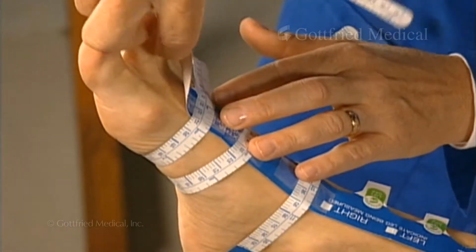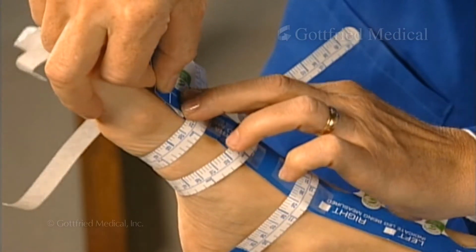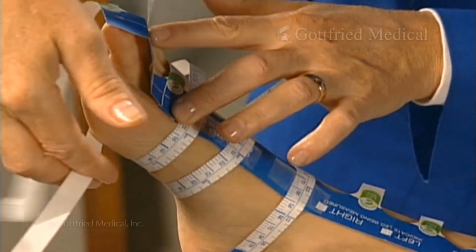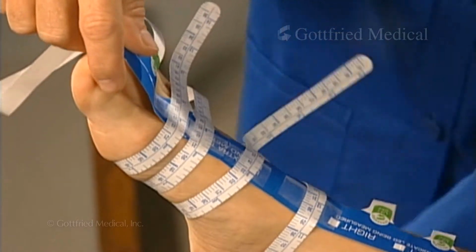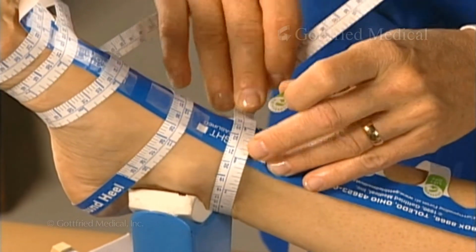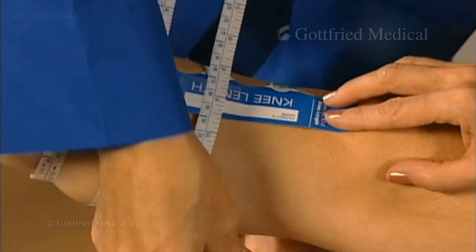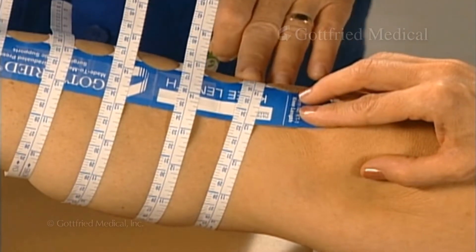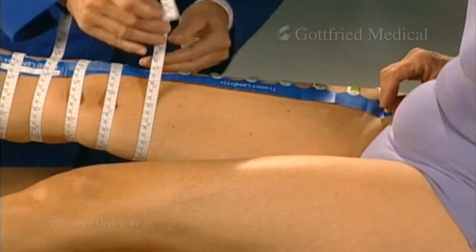To ensure correct placement, you may need to pleat the tape to shorten the distance between 2 straps. As you fold the tape, make sure to keep the spine in a straight line. Secure the pleat with transparent tape. Then continue measuring up the leg from the 0 strap. If you are measuring for a knee-length garment, the last strap should end approximately 1/2 inch below the bend of the knee. Again, pleating may be necessary for proper placement.